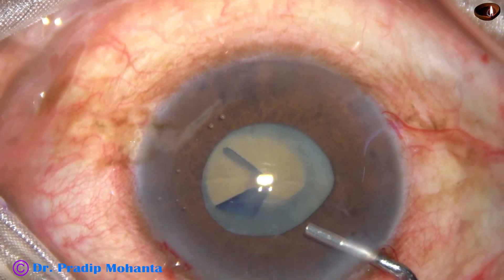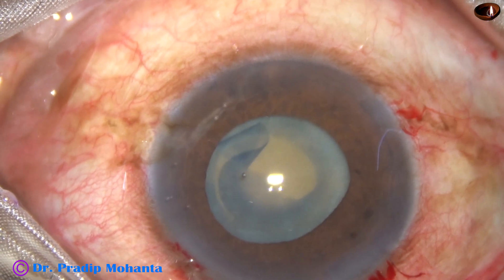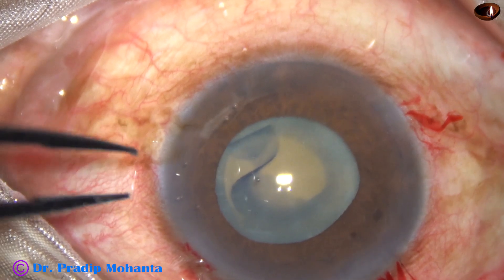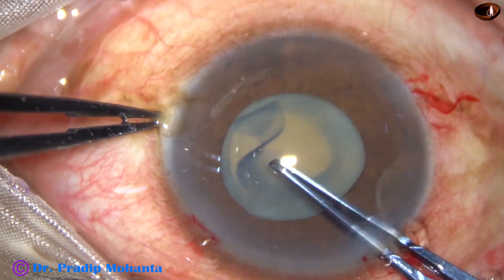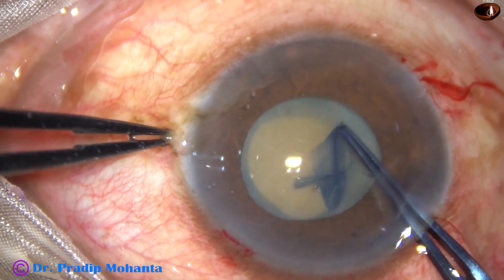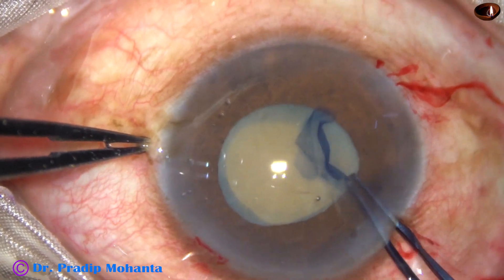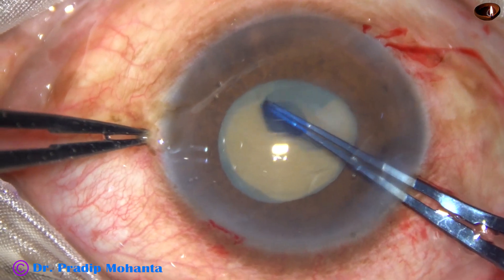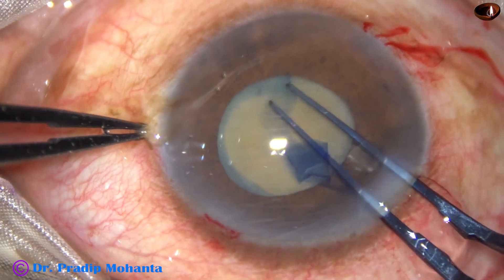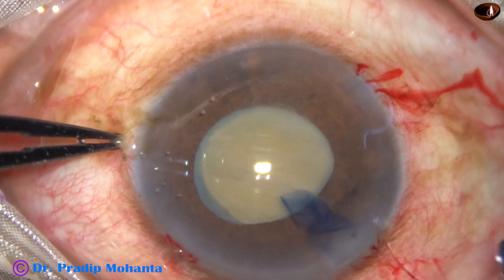Now, after aspirating some milky fluid, visco is again injected. Now we can see well. Though the pupillary size is about 4 mm, we can make an adequately sized rhexis going beyond the pupillary margin in some places. Here I am trying to go just beyond the pupillary margin — and yes, this makes the rhexis size adequate.